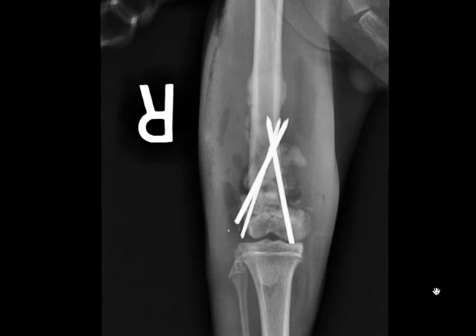I'm just going to show this one view quickly. I want you to notice that the soft tissues of the thigh have become thin. This can happen during fracture repair, especially if the animal is inadequately using the limb, as with certain fracture complications. You might also notice that there's some gas in the soft tissues again. This is because these new, longer implants have just recently been applied.